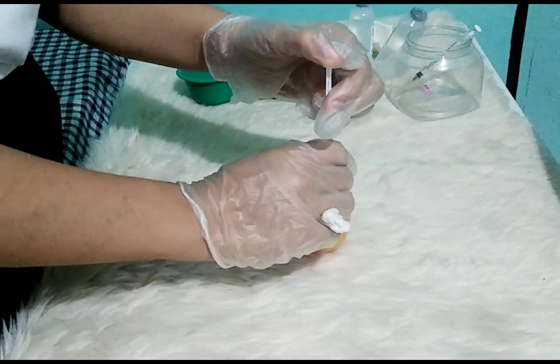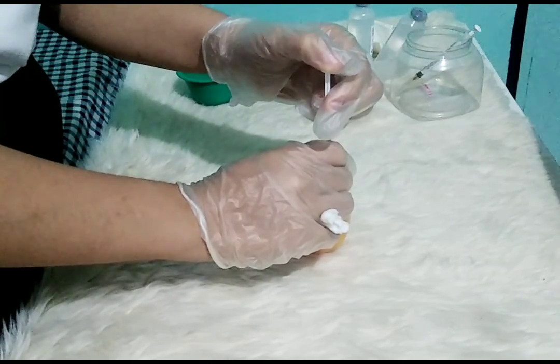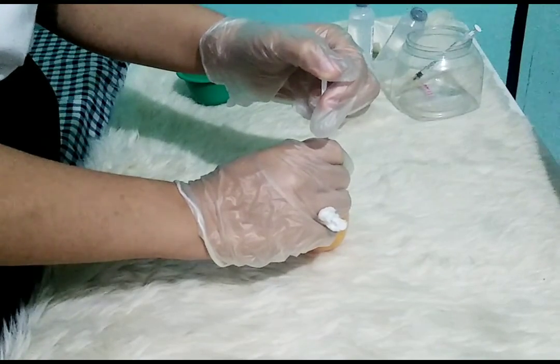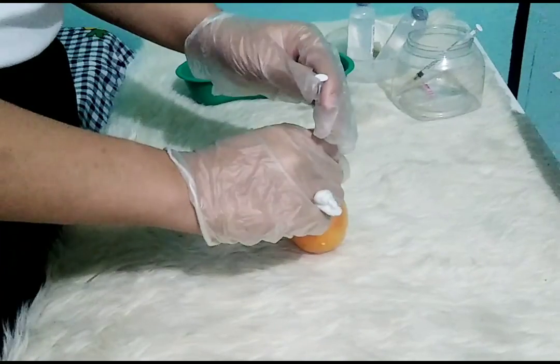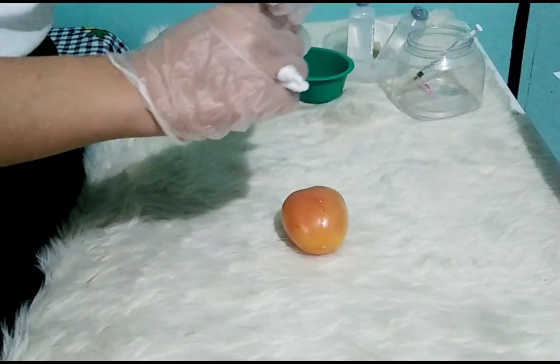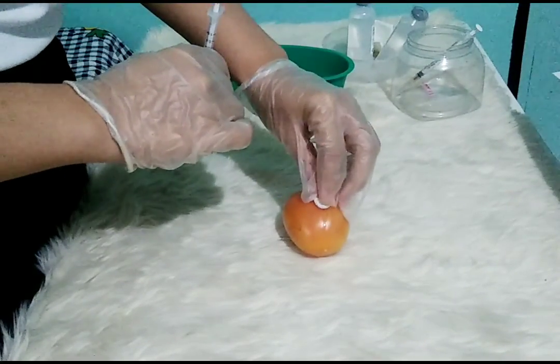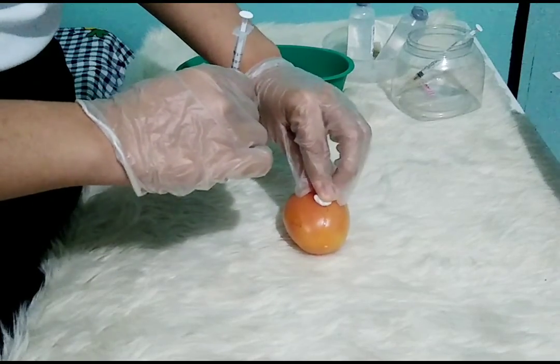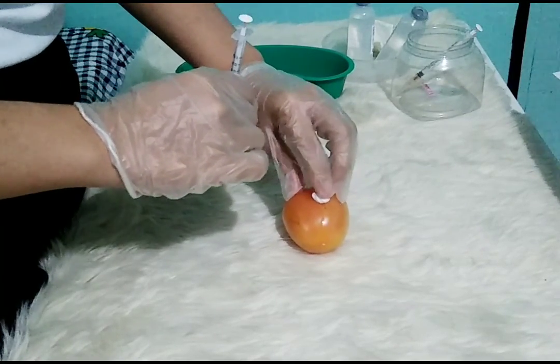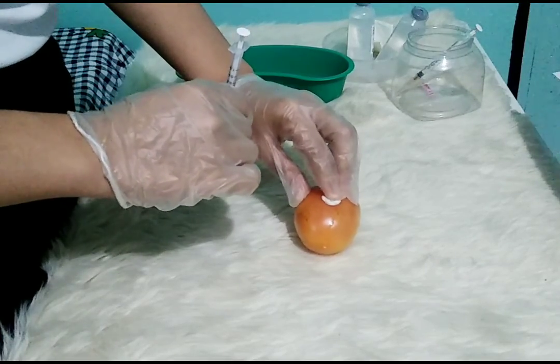Wait 10 seconds after the injection. Withdraw the needle smoothly at the same angle of insertion and release the skin. Apply gentle pressure at the site with a dry sponge. If bleeding occurs, apply pressure with dry sterile gauze until it stops.